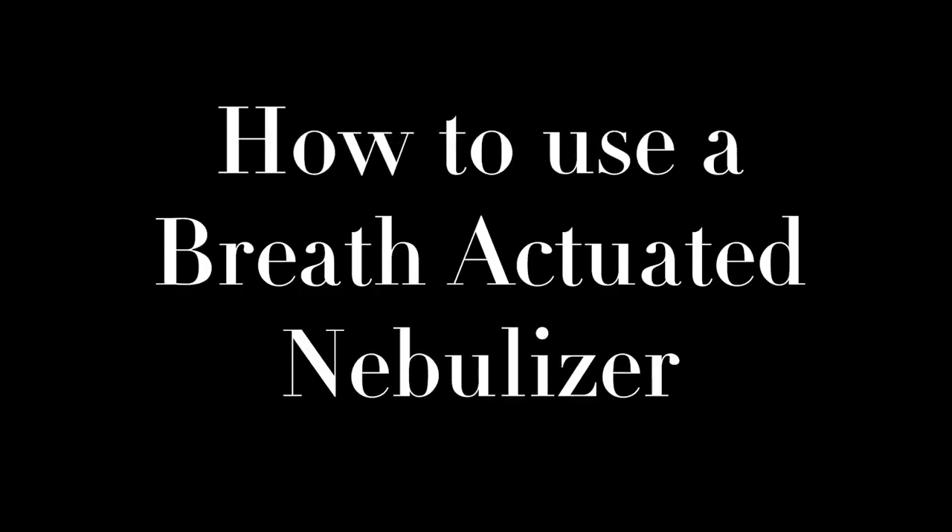This video will show you how to use a breath actuated nebulizer. Breath actuated nebulizers are similar to jet nebulizers that you might use when you're in the hospital.